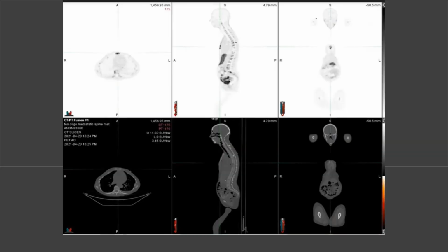This is a patient who received FES imaging. The FES images are on the top, the CT is on the bottom. This is the same patient in transaxial, sagittal, and coronal views. You'll see in T11 there is a nodule that was hot on FDG but cold on Cerianna. Any nodule in osseous or body that is cold is a spot that is missing estrogen receptors. You'll see it down here in T11. You can see my mouse pointing to it right there. It's appearing cold on the FES images.